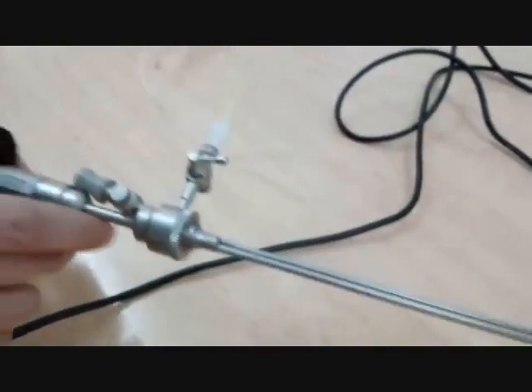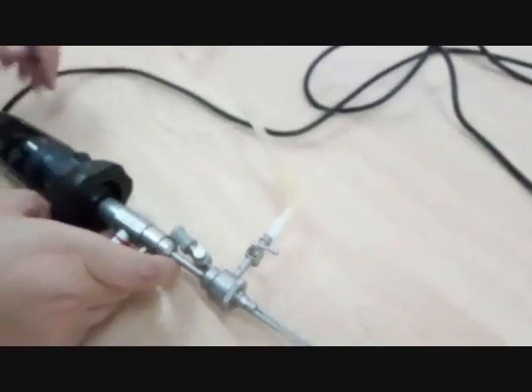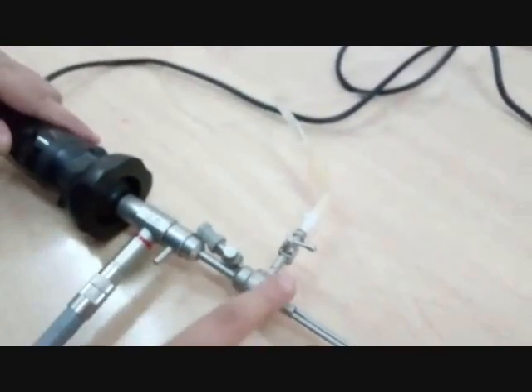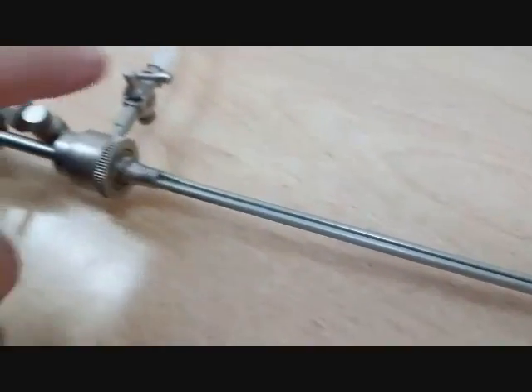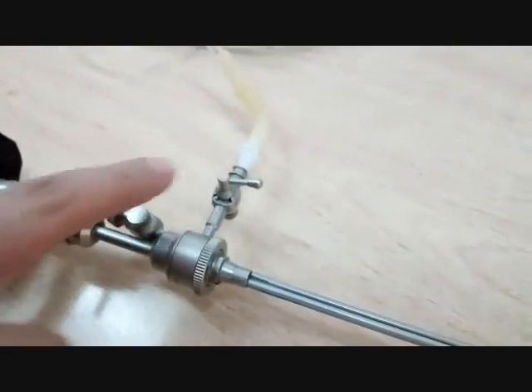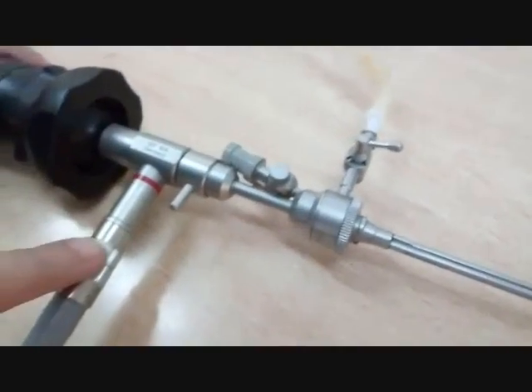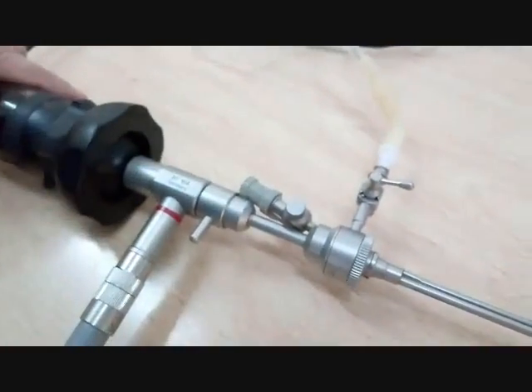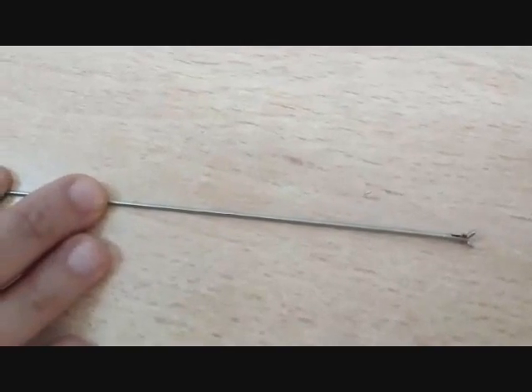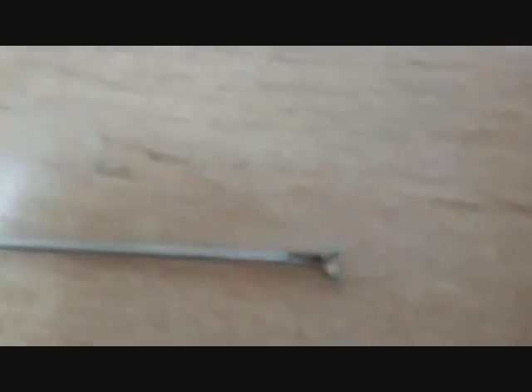So again, here's the scope inside its inner operating sheath. There. An irrigation connector, a light attachment, the camera, and the working channel. Here's an instrument. It's a biopsy forceps, 2 curettes. It looks like that actually, but I know you can't see it with the bad image quality. Sorry.